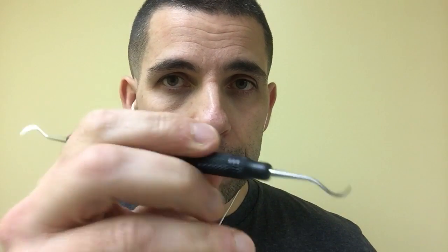Number three is hand scaling. This is my American Eagle Blackjack — it's my workhorse. You can feel calculus with this. It's not as good as the Perio Explorer, but you can feel, and it helps to take your time with a light grip to help feel for calculus.